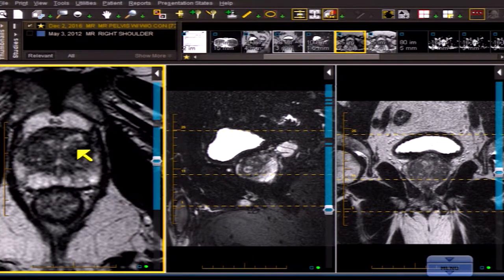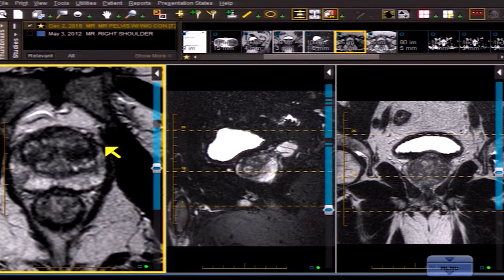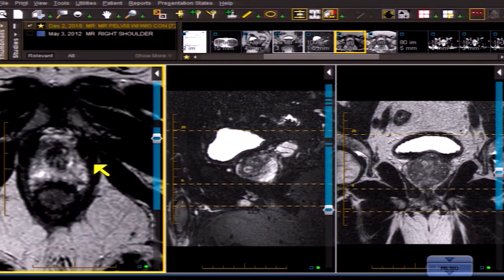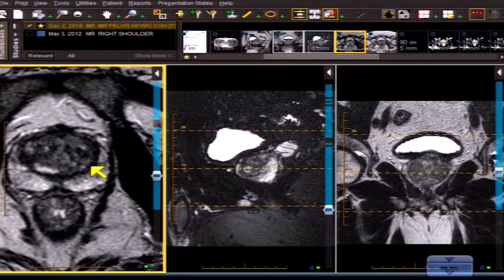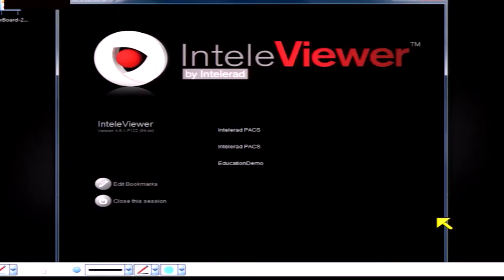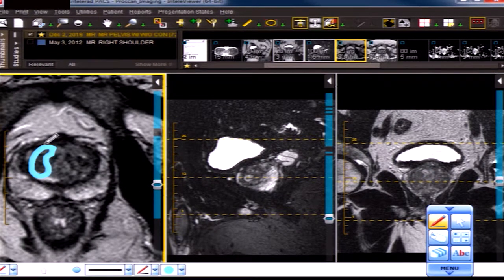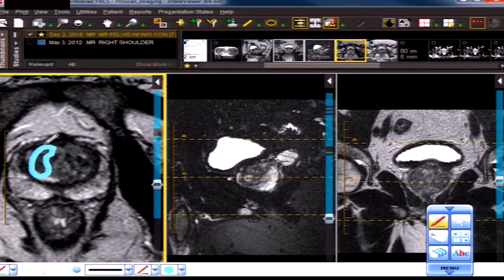Shape descriptors: round is self-explanatory. Oval — you've seen lentiform cancers previously; when cancers get pretty big they often have an oval-banana shape, especially when they cross from the central zone to the peripheral zone — that's a very common appearance, also common on diffusion-restricted images. Lentiform means having the shape of a double convex lens.